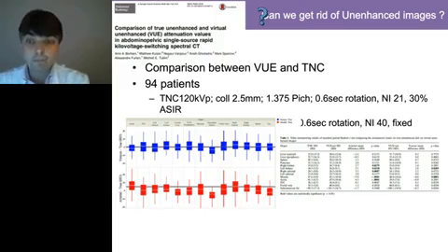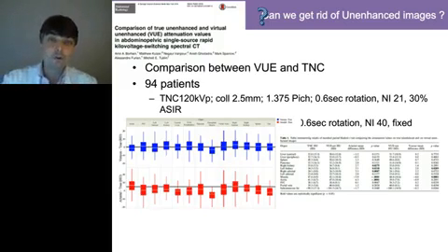What that study shows in 94 patients is that there's actual fluctuation, close to 10% of fluctuation, in the actual Hounsfield units that you can measure on the virtual unenhanced images reconstructed from an IV injected spectral acquisition. What that means is that you shouldn't be using the virtual unenhanced images for measuring the Hounsfield units if what you are measuring is at that level of uncertainty, that 10% uncertainty.